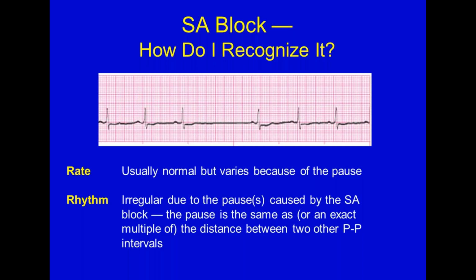That's one of our issues. If we put a Holter on somebody who thought they had an irregular heartbeat, we might catch these things. But we throw the monitor on somebody, we print a little strip and hand it to the paramedic, and the monitor's over there running, but we're not really watching it. We don't sit there and look at it or print the whole time.